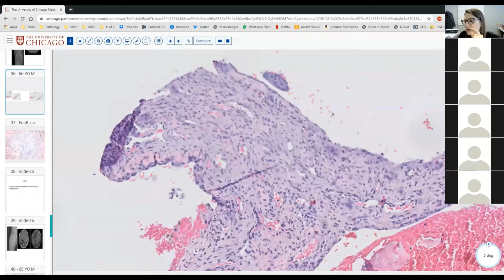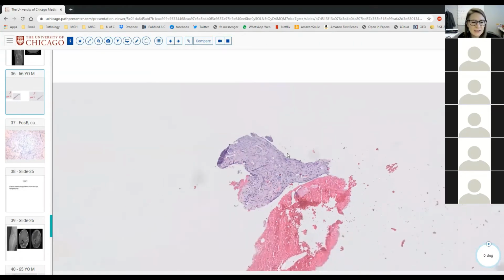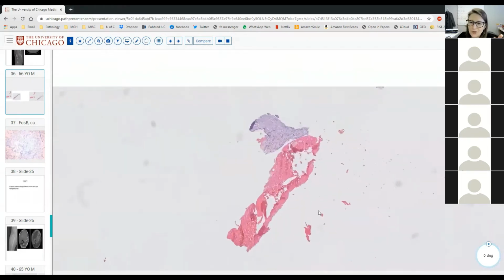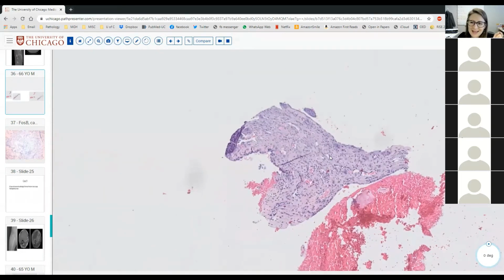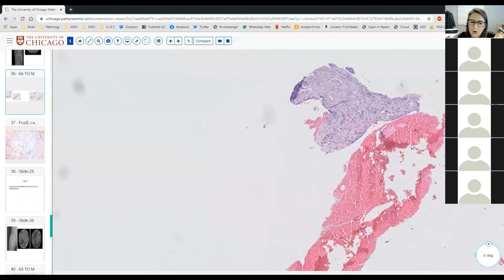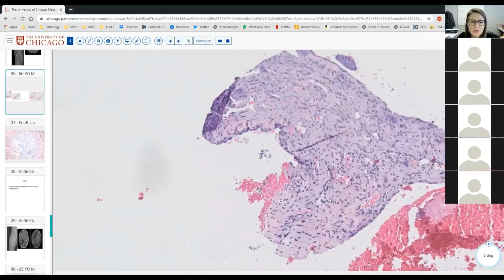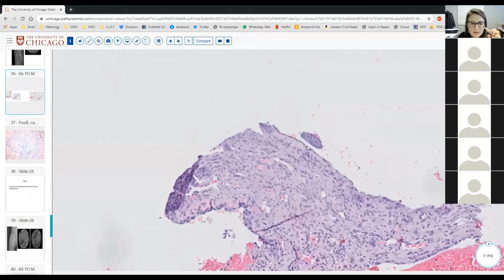So there's one maybe tiny extra clue. Yeah, malignant osteoid would be very lacy, would be entrapping malignant cells, right? By definition, that's malignant osteoid. So there's two things here on this other piece of tissue that actually I think are a little more helpful. If you look at this tiny little piece of tissue, one, we see blood, all right? And two, we see almost like a little, I'm sorry that this part of the scan is a little blurry.